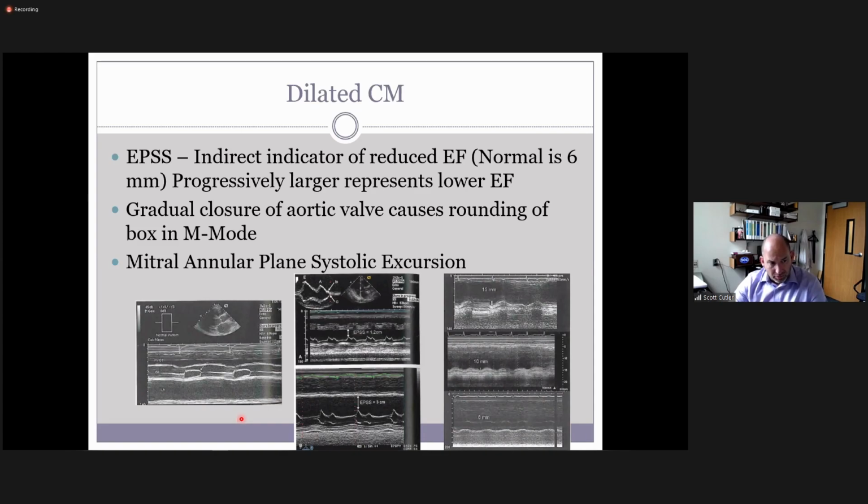So I say that because if you see the valve really well, that might mean one of a couple of things. That is that either you've got a super easy to scan patient, which we know from our lab alone, good luck. None of us are that good of a scan in most cases. In a normal aortic valve, it's difficult to see the whole box, let alone the beginning of the box. So if you're seeing the box really well, again, it's either your super good window, or we have a thickened valve, which in this case is true.